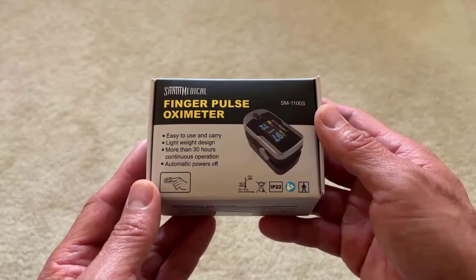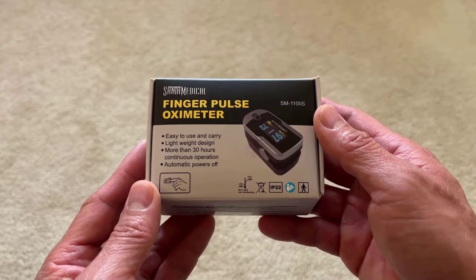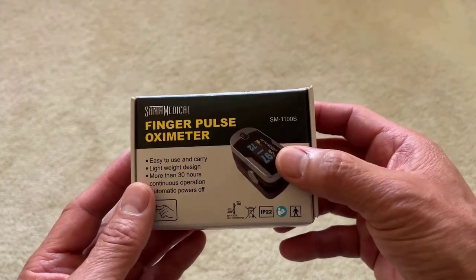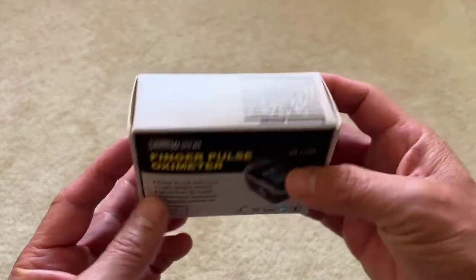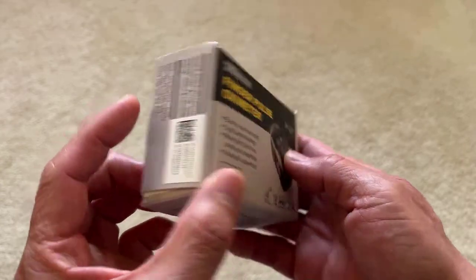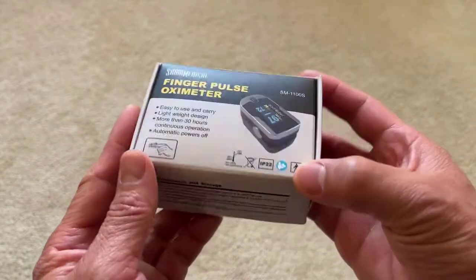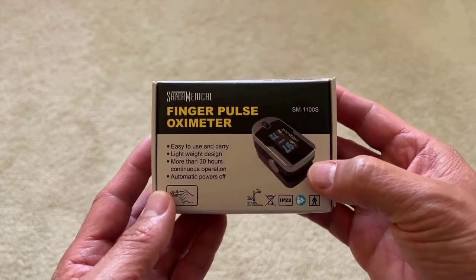Hi, in this video I'll be covering the Santa Medical Generation 2 Finger Pulse Oximeter. This oximeter is a quick and precise way to check your pulse or heart rate and blood oxygen saturation levels. The 'two' describes the fact that this oximeter measures two functions: your pulse rate and your current level of oxygen saturation in the blood.